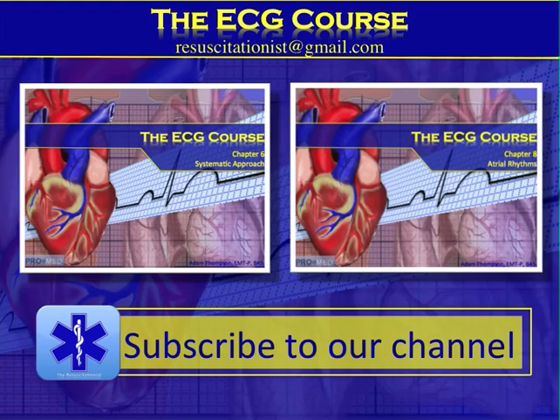So that was our very first chapter on actual EKG rhythms, and of course we started with the normal ones and we moved a little bit into the abnormal. Next, in chapter 8, we're going to talk about atrial rhythms. So if this was too much for you, you could start going back by talking about the systematic approach in chapter 6. Okay, if you're ready to move on to the next chapter, click on that picture on the right and we'll move on to atrial rhythms.